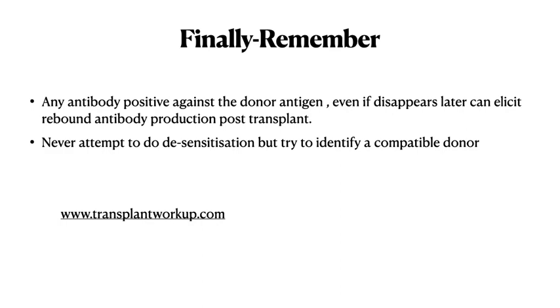And also I need to tell you one extremely important thing. I almost forgot to put it. In fact, I didn't make the slide in this video. That is, never ever do the lysate DSA, it's called Luminex cross match or Luminex DSA. Never do that. The reason is, this test is never done in most of the advanced transplant units, because it comes with so many false positives and so many false negatives that it confuses everybody.